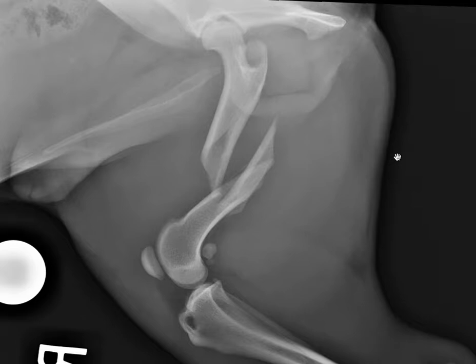Let's start by composing our fracture sentence. I like to describe the location, the fracture type, the displacement, and the soft tissues.